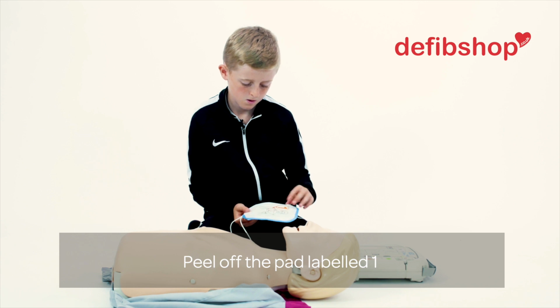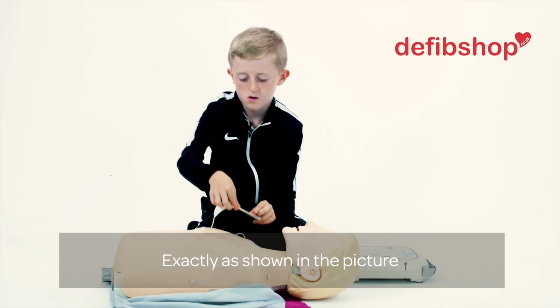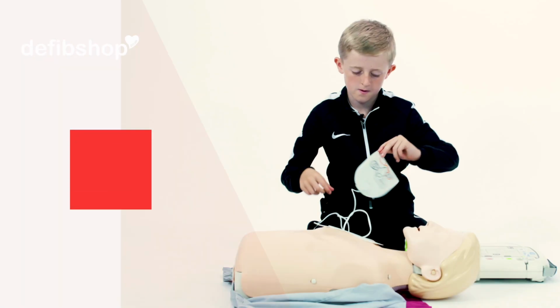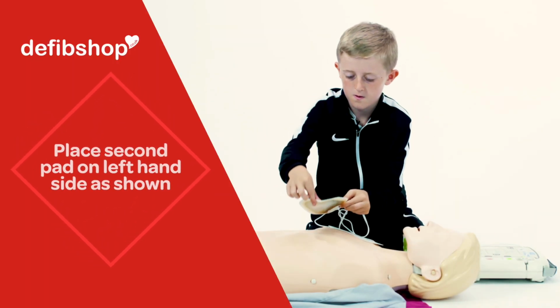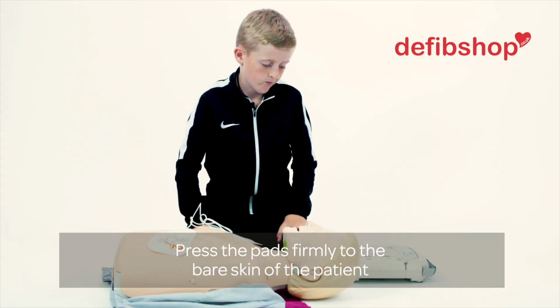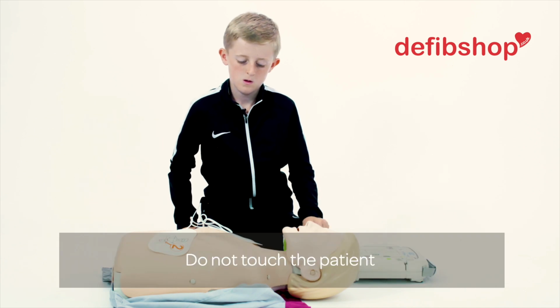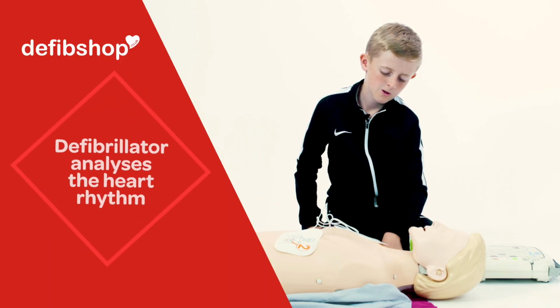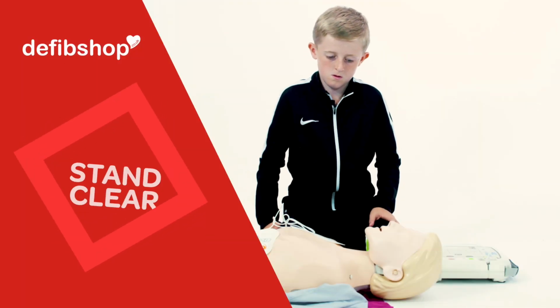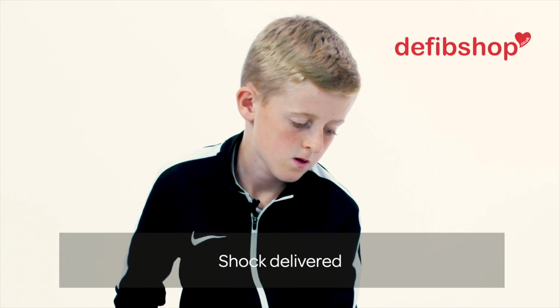Peel off the pad labelled 1 and stick to the bare skin of the patient, exactly as shown in the picture. Peel off the pad labelled 2 and stick to the bare skin of the patient, exactly as shown in the picture. Press the pads firmly to the bare skin of the patient. Do not touch the patient. Analysing heart rhythm. Shock advised. Stand clear. Press the flashing orange button. Shock delivered.